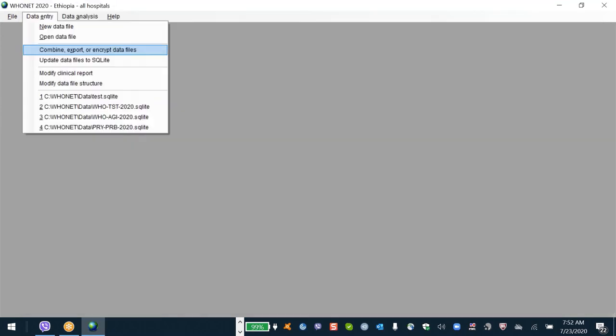But if I'm doing a publication about those 100 files, I do find it personally convenient to combine all 100 files into one very large file. I don't have to do that, but it just means when I'm doing my analysis, I don't have to select 100 files. I just choose one very large one. After the publication is done, I have two choices. I can delete that file because it is really just temporary, or I'll zip it up and keep it as an archival thing and connect it to the publication for later convenience if I ever have to redo anything.